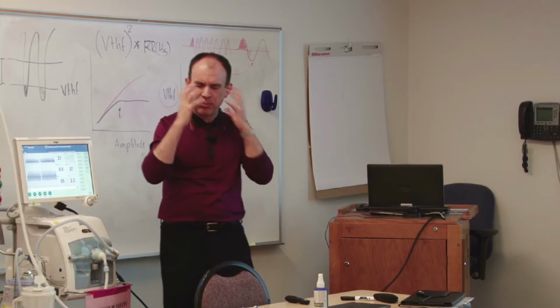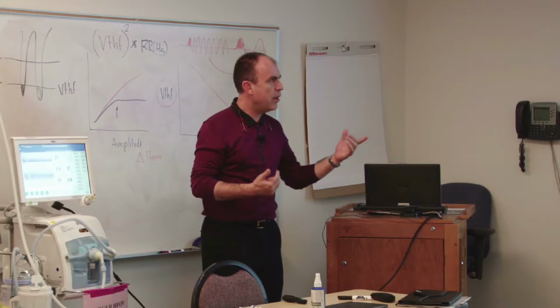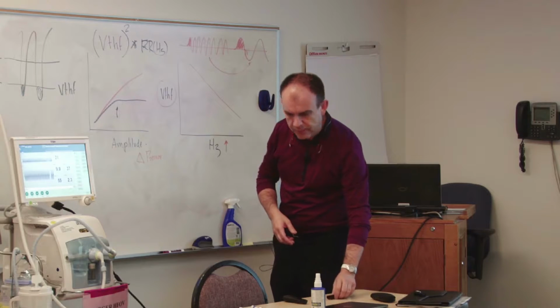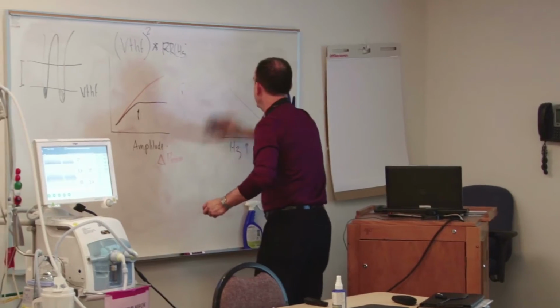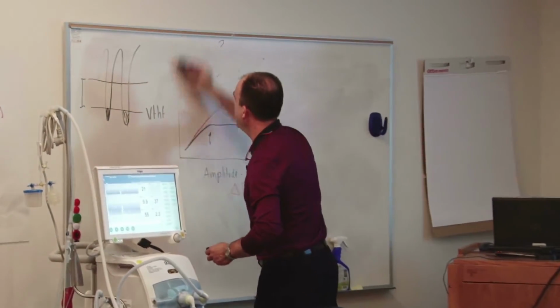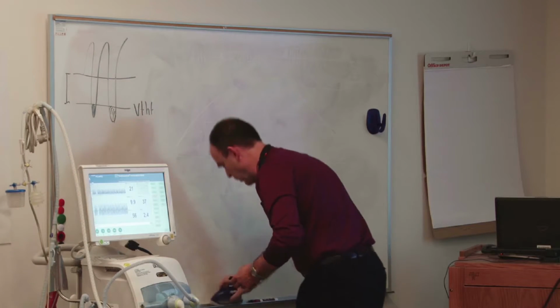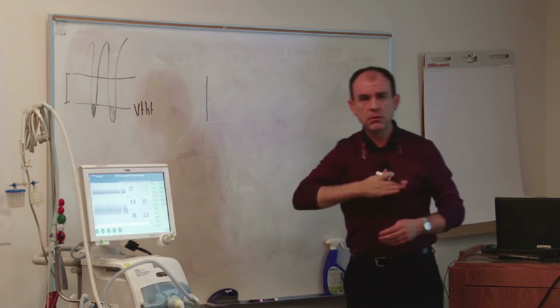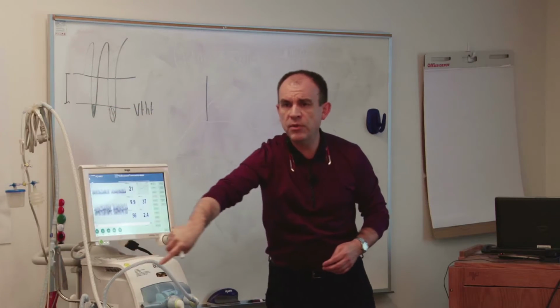And what I find interesting with this type of ventilator, and it's changed completely our way of ventilating, is the fact that we're seeing more. Why? Because basically, as I said yesterday, we have a midpoint that we didn't have before, which is we know that what's happening in the machine gets attenuated more and more as we arrive to the patient.